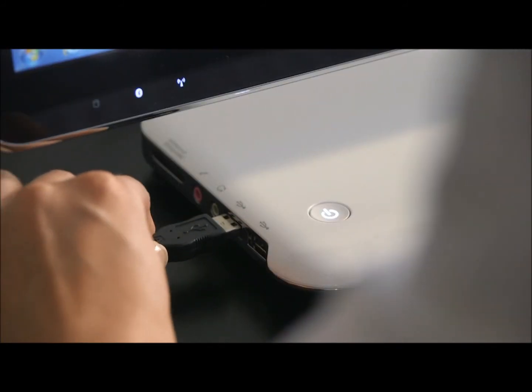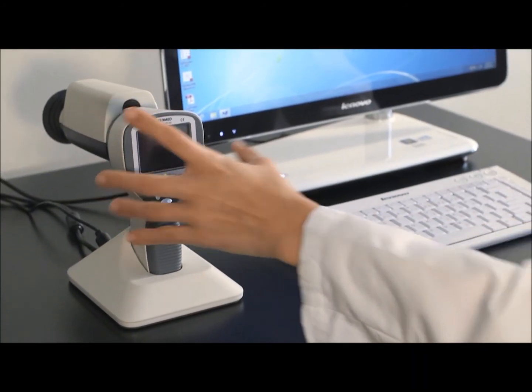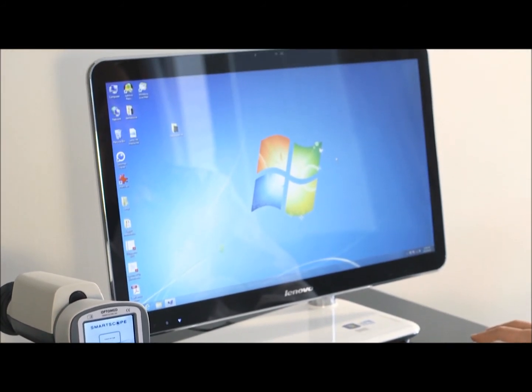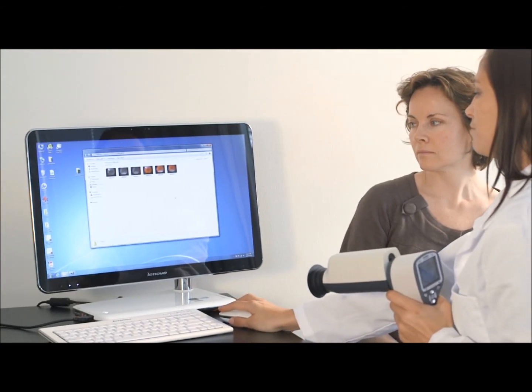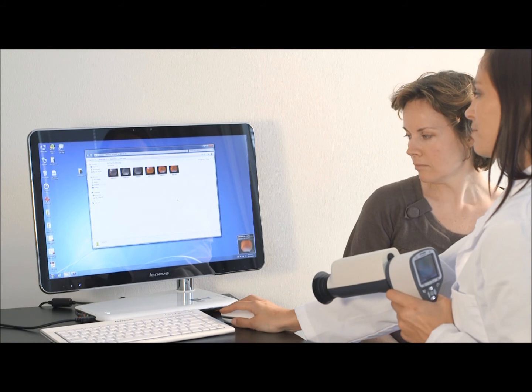Images are uploaded to the computer by placing the camera on the cradle. Image transfer works through USB connection in a similar way as with any other digital camera. It is also possible to transfer images with Wi-Fi, as the taken image will wirelessly appear on the computer screen right after the image has been taken.